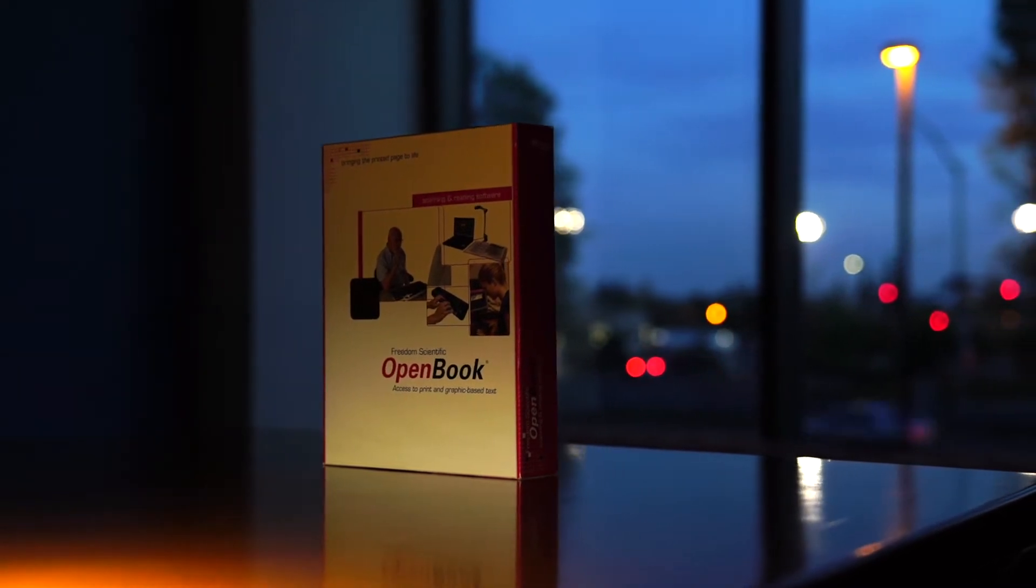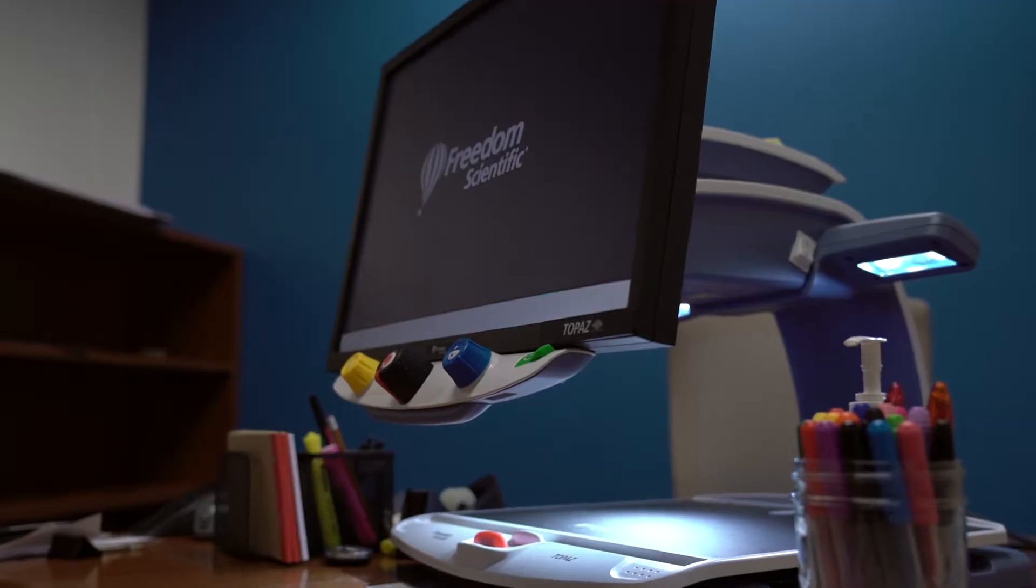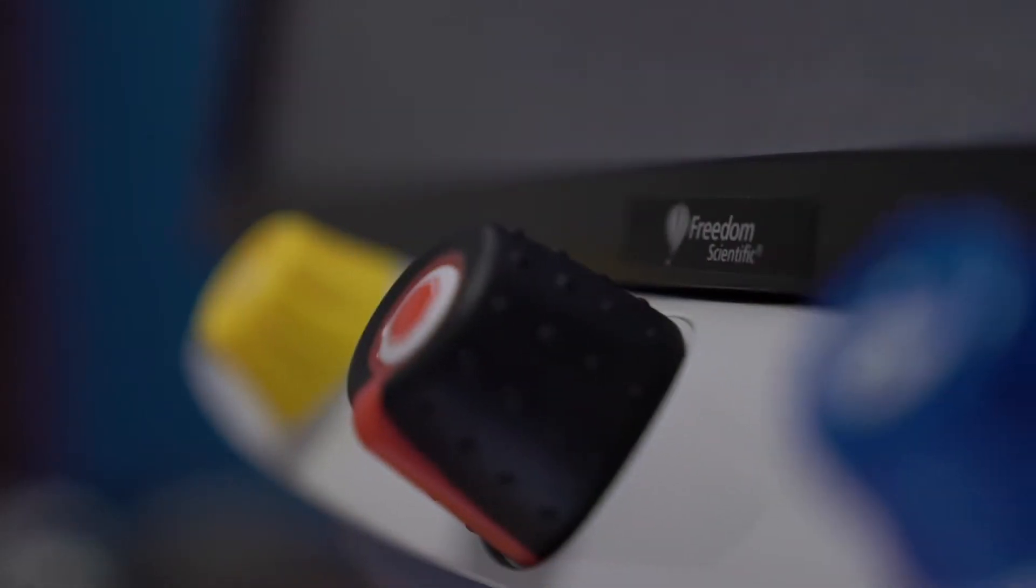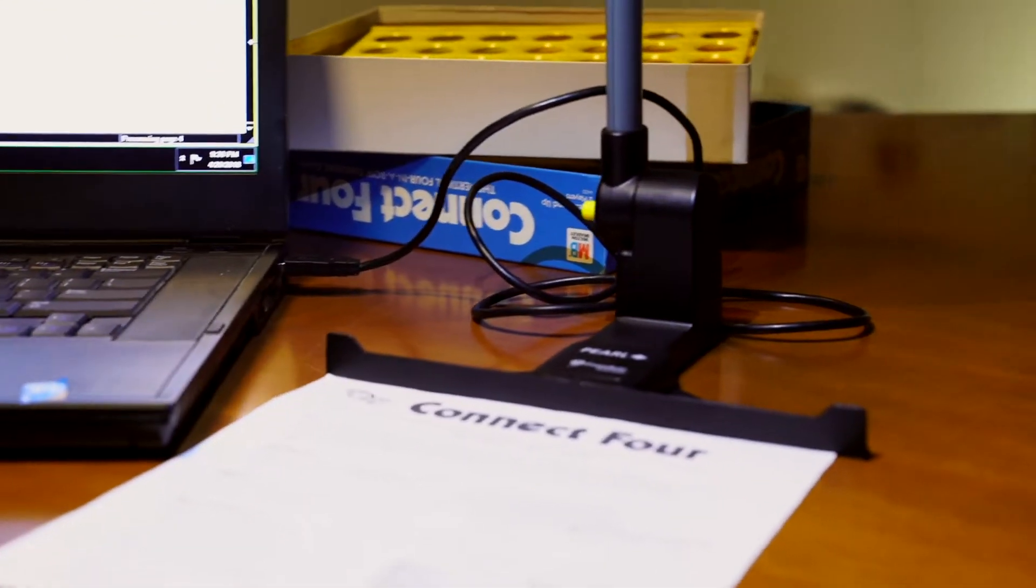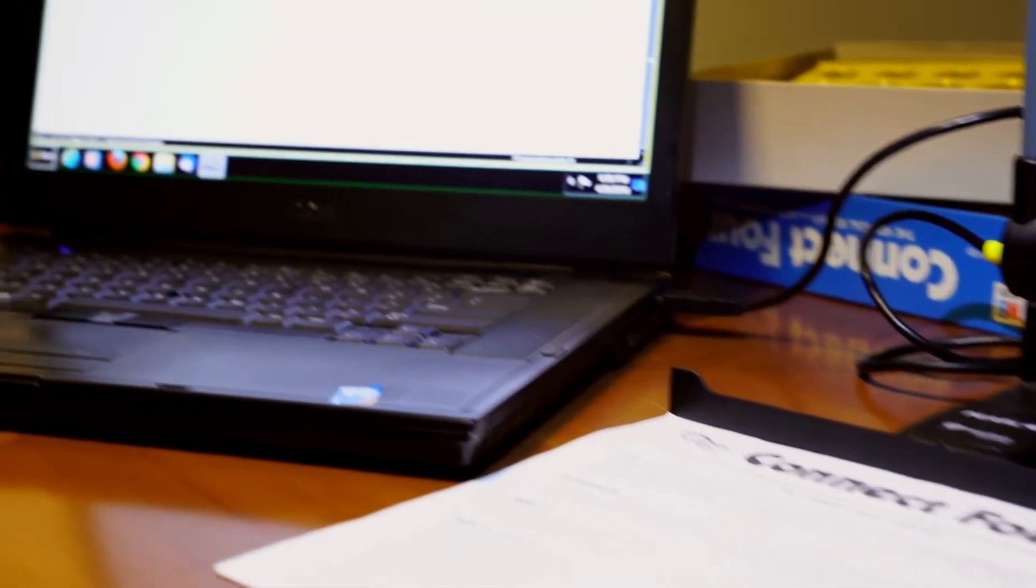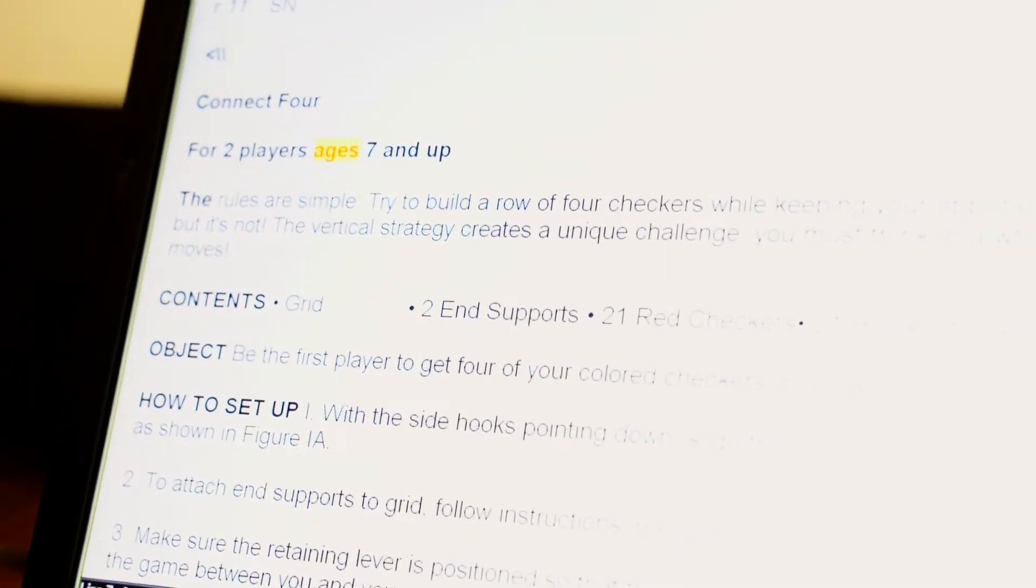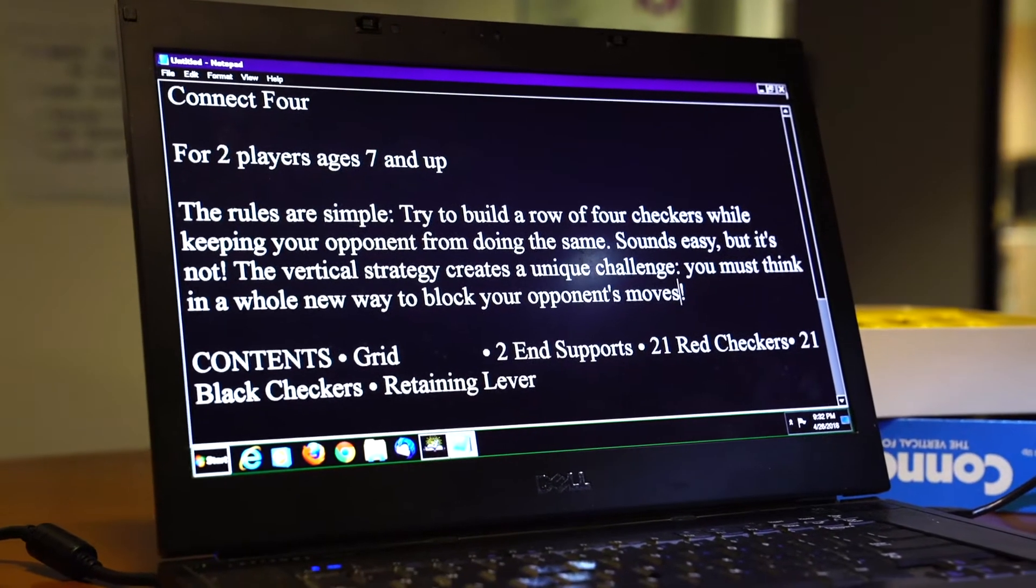This is Open Book, a program designed by Freedom Scientific, an assistive technology company whose CCTV device made an appearance in our last episode. Open Book is a program that converts documents into digital text using Optical Character Recognition or OCR for short. The program is designed only for Windows computers and comes with a desktop camera that plugs into your computer and enables you to load these digital documents on your computer via Open Book software or other word processing programs like Microsoft Word.